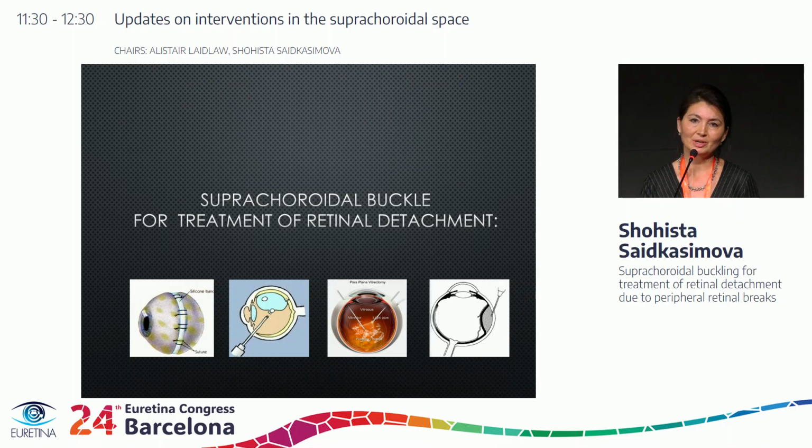So we've been hearing quite a lot of very interesting discussions at the Euretina Congress this year about the different approaches in the management of retinal detachment, starting from the classic scleral buckle to different variations in vitrectomy technique to even an excellent debate on the use of pneumatic retinopexy for selected cases of retinal detachment.